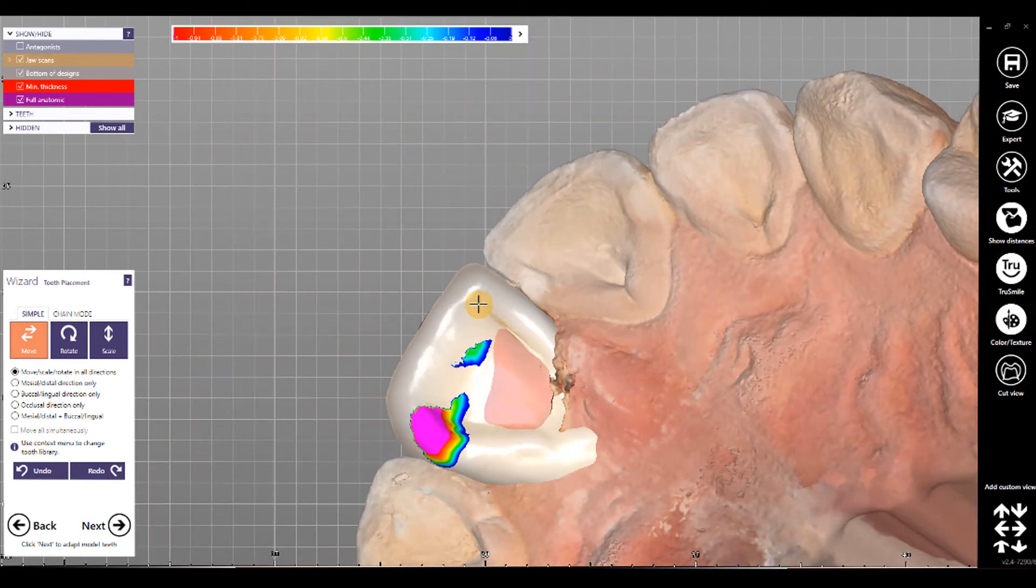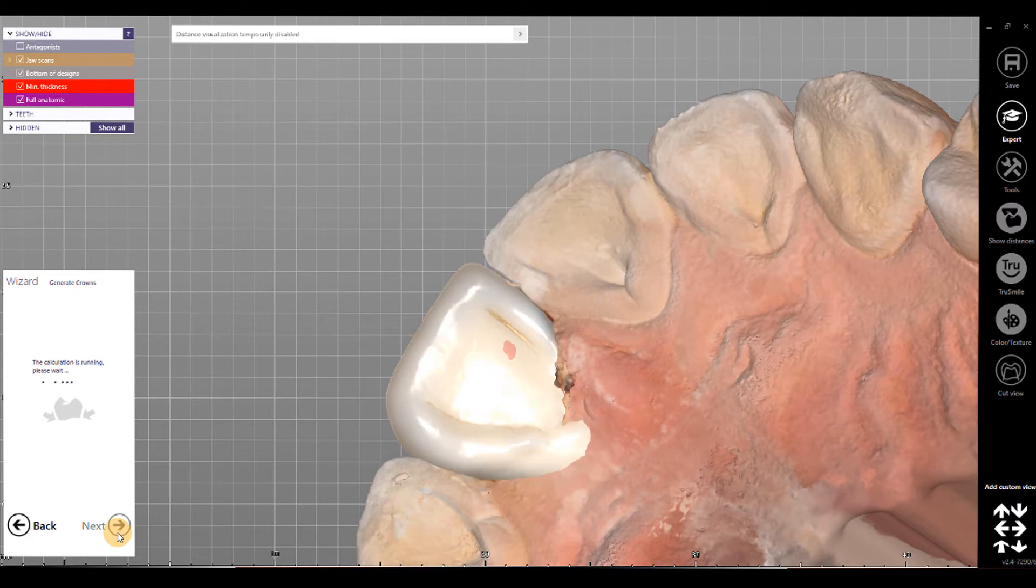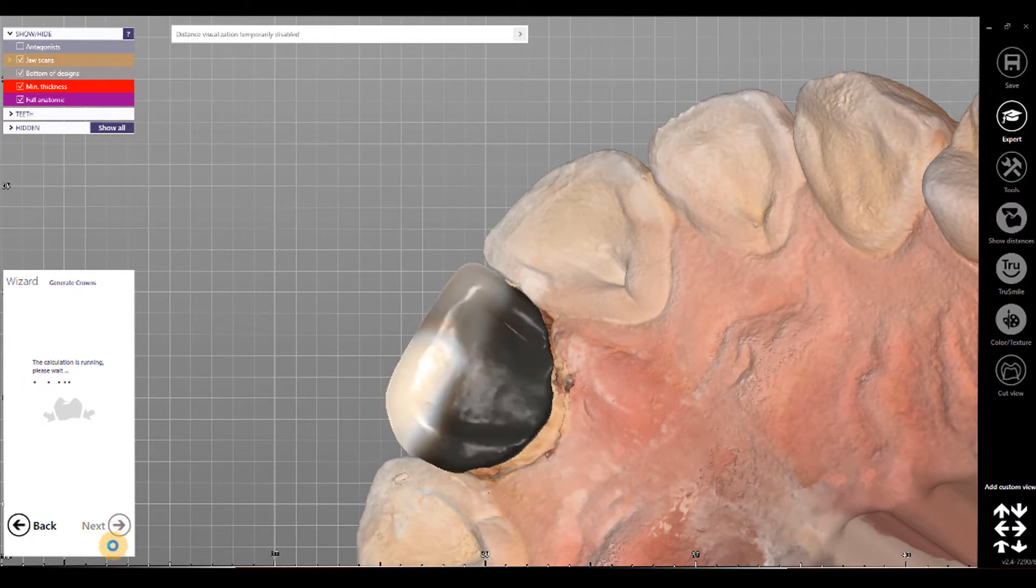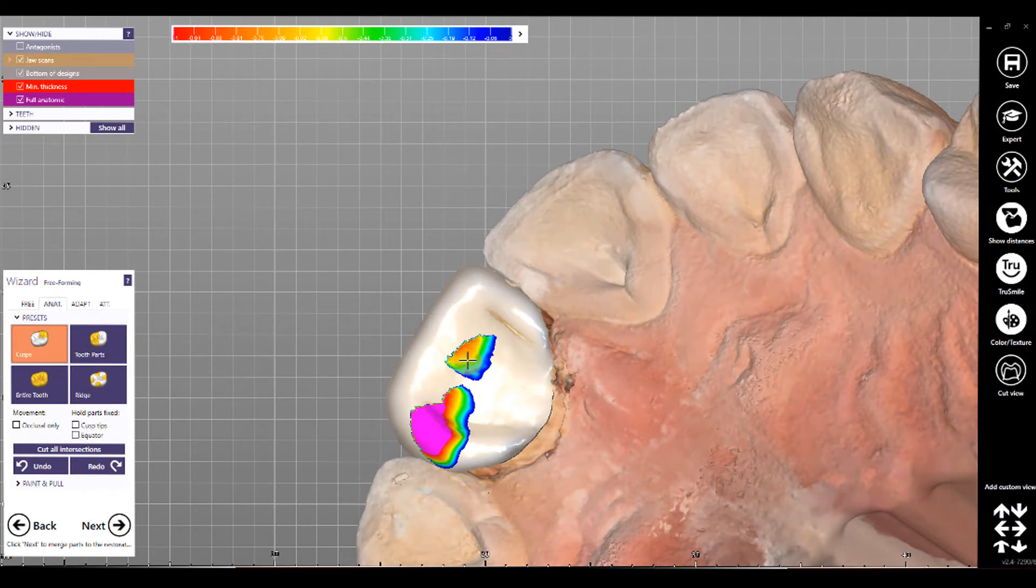I've checked the occlusion now. So I go to next. This is, in general, the form that I would want. Let's say, not in reality, just for demonstration purposes.